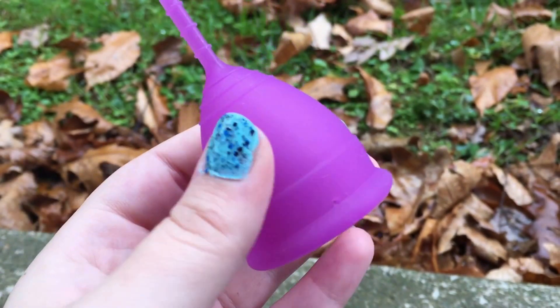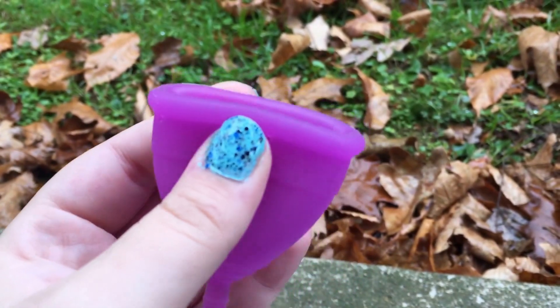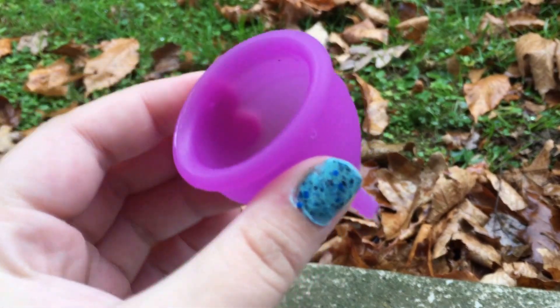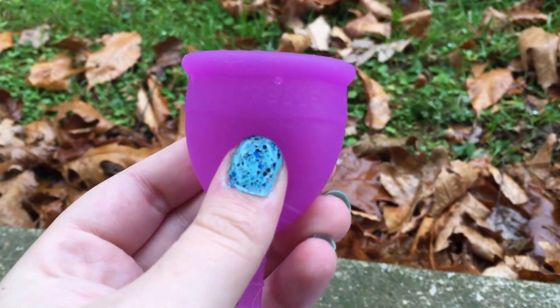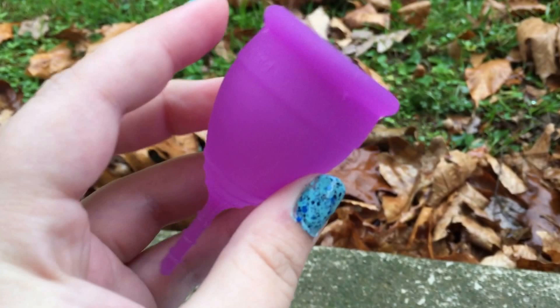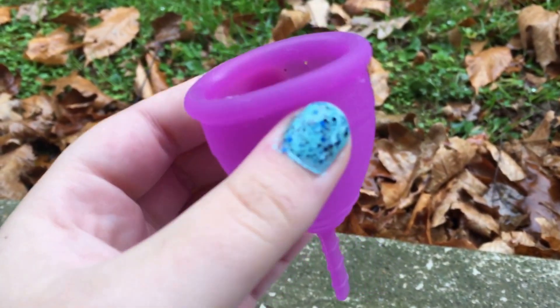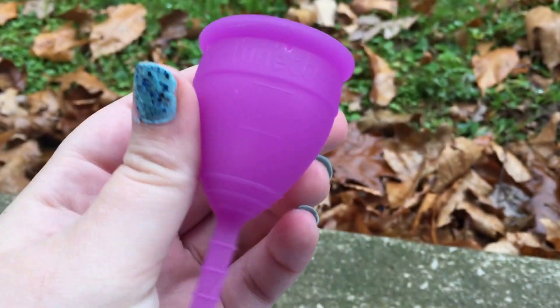From what I understand, it is a soft cup. I do find that the rim is slightly less firm than my menstrual cup, but firmer than my smart cup — and my smart cup is not even close to being firm, it is very very soft. From what I understand the menstrual cup is also a very soft cup, but it is more firm than the smart cup and a little bit more firm than this Lunette.